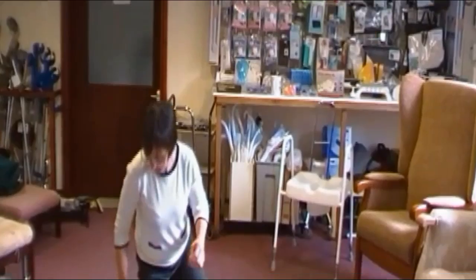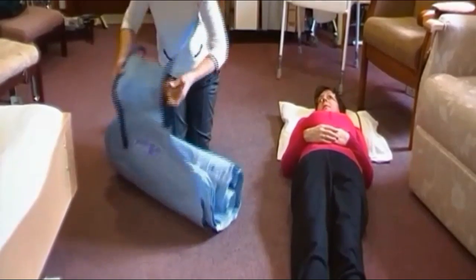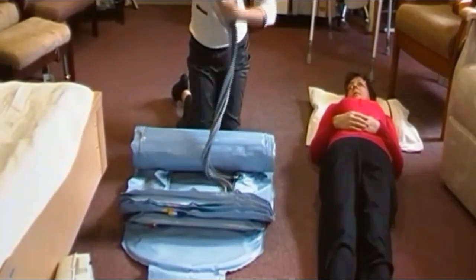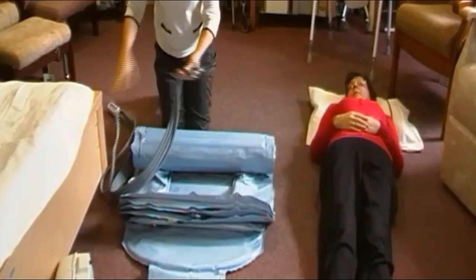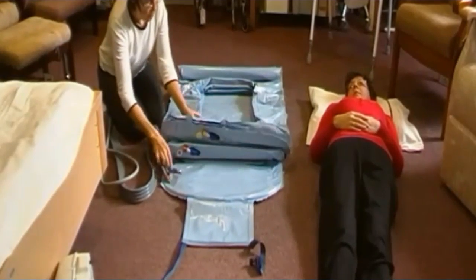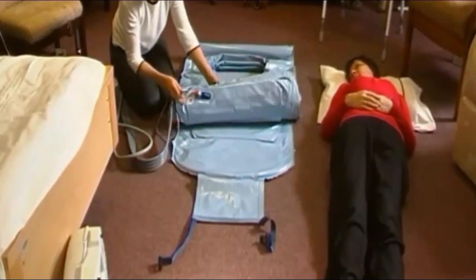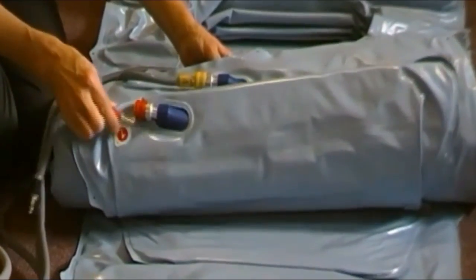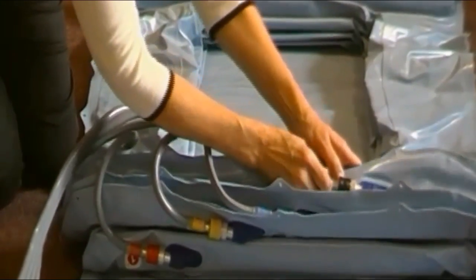So what we do with the camel, we unclip it, connect the air pipes, similar to the elk. They're all numbered and coloured, so it should be foolproof. Put number 3 in blue, number 4 in yellow, number 1 in red, and number 2 in black.